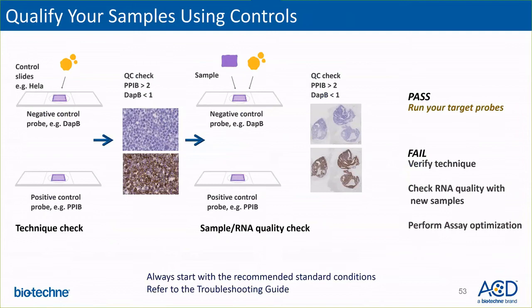Before we move forward, I would like to reiterate that it is critical to qualify your sample using control probes before running the assay using the target probes.